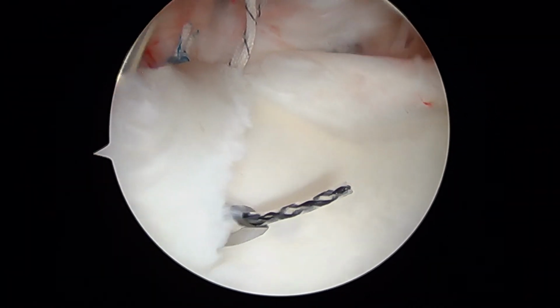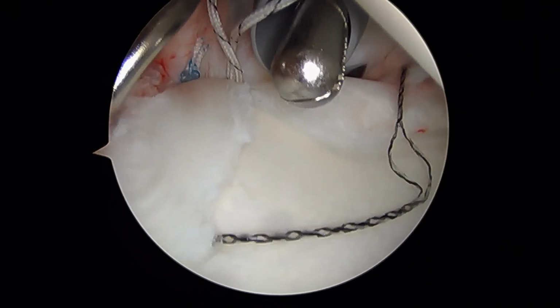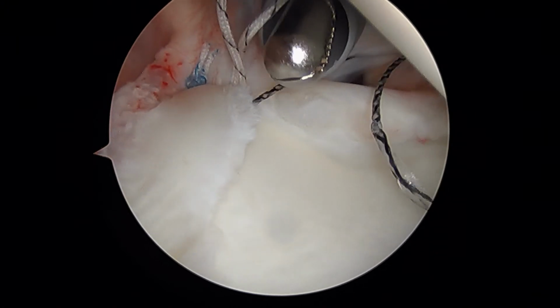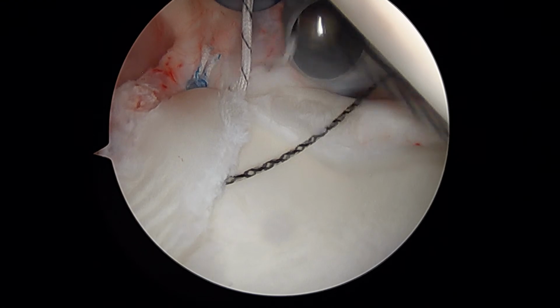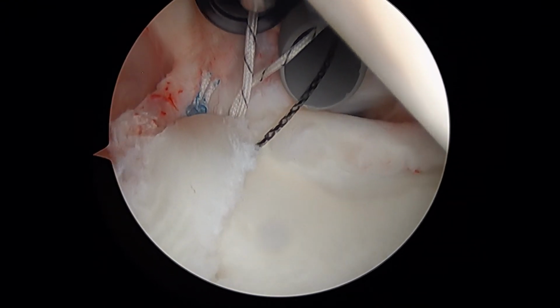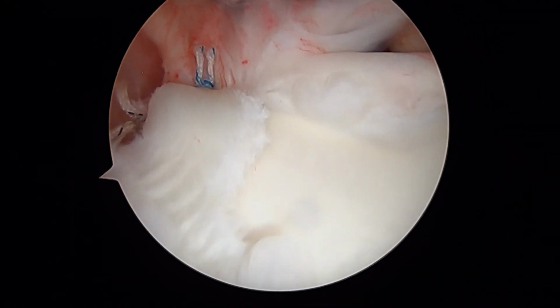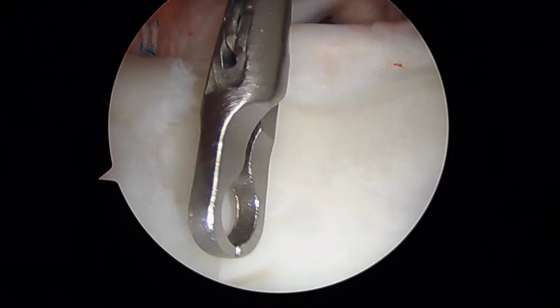Okay, so there's our second stitch. We'll feed that through a bunch, back the needle out, and we'll go ahead and retrieve the relay here, just like we showed you before. Okay, pause. Here you go. Okay, so we've got two sutures holding down this labrum. It looks like it's more stable now.